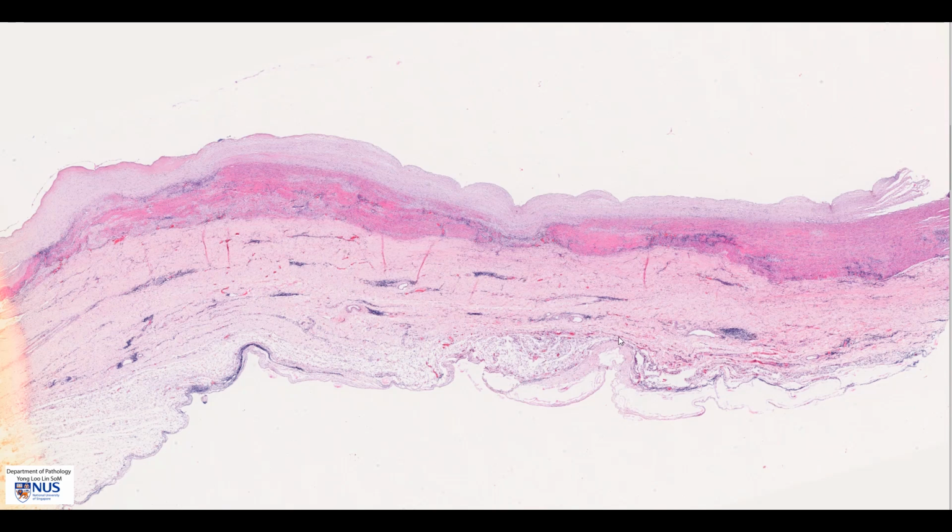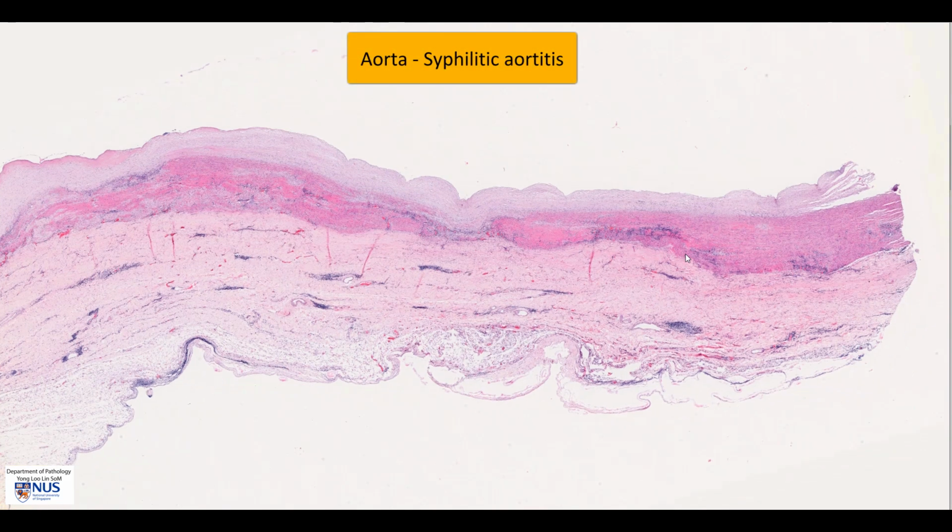Hello, this is a virtual microscopy slide of an aorta with syphilitic aortitis. Let's orientate ourselves first. This is the intima of the aorta, which is the innermost layer.